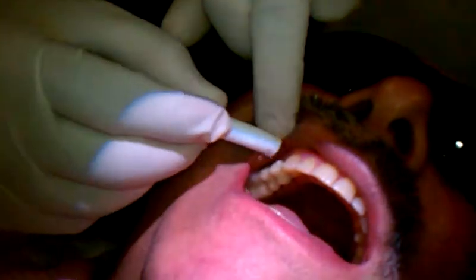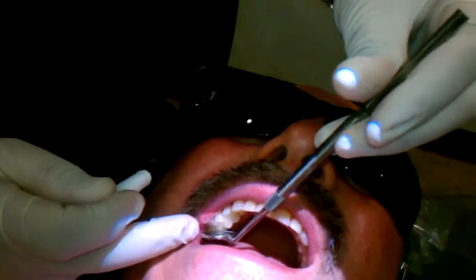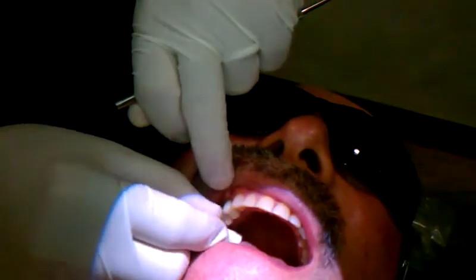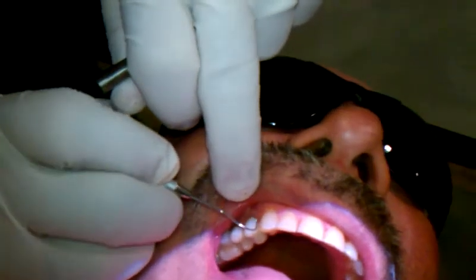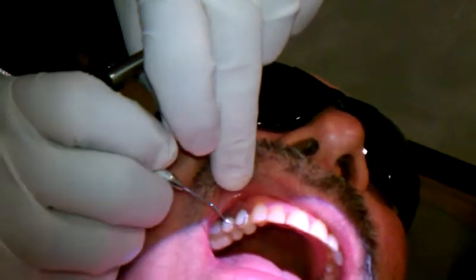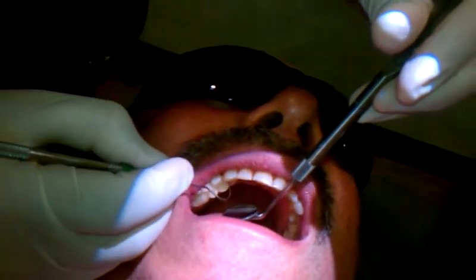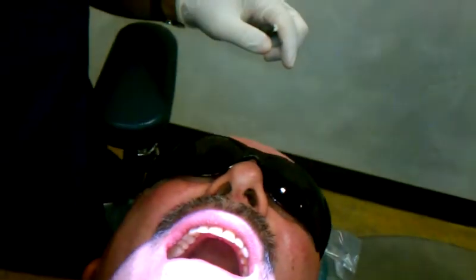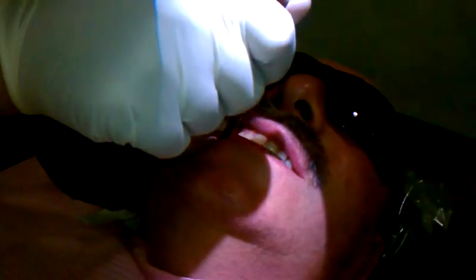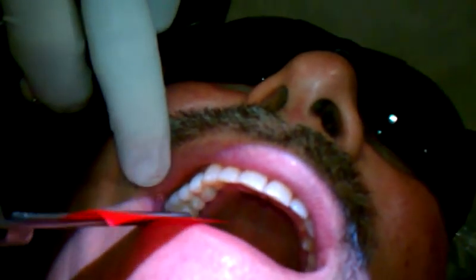Bite down please. Okay, thank you. Tap, tap, tap. Let's do articulating paper just in case. Okay, and floss please. As you can see, there are articulating markings on the temporary — there's some here. I want to make sure that it's okay and it's not high.